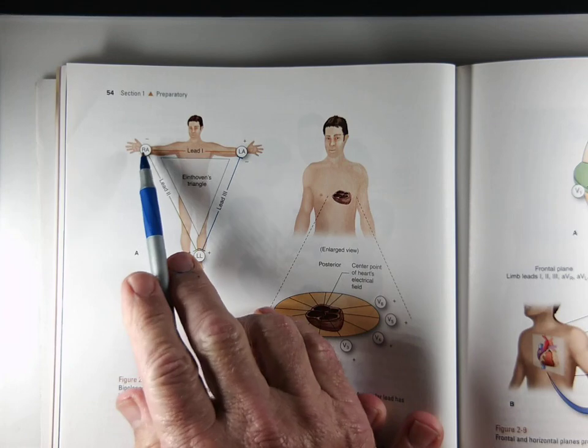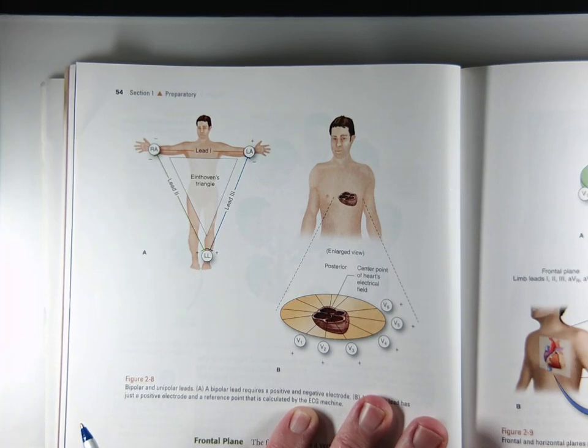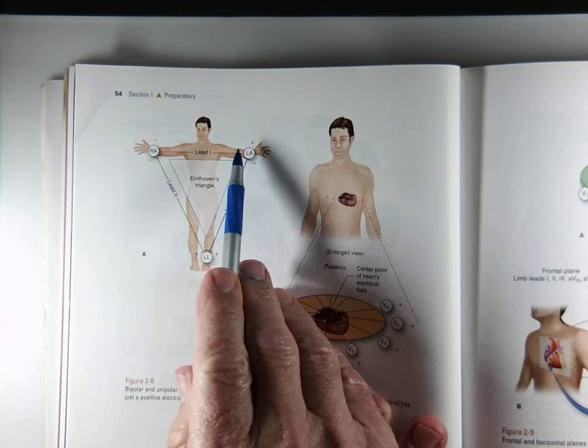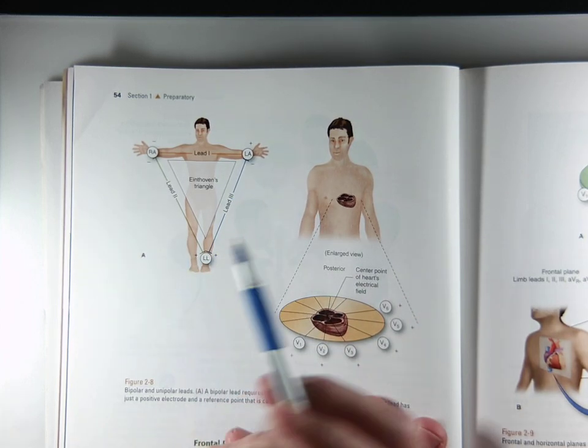Well, the limb leads we start with are right arm, left arm, and left leg. The right arm is negative always, okay? The left arm is positive when it's from right arm to left arm, but it's the negative electrode when it's going down to the feet. The feet are both positive. So what does that mean?